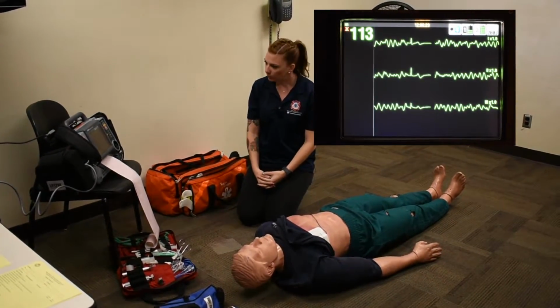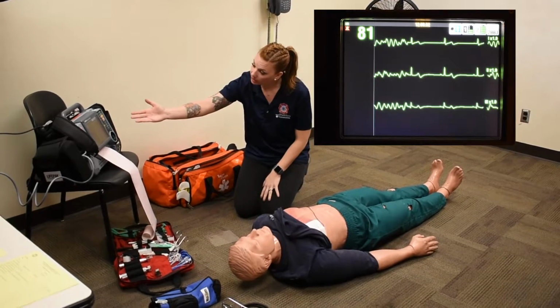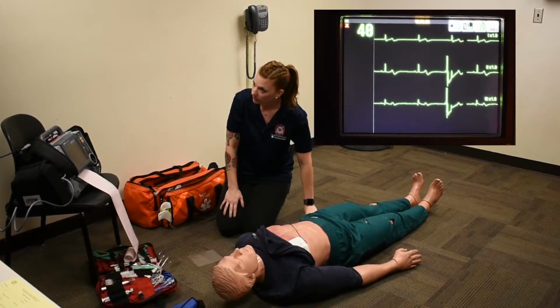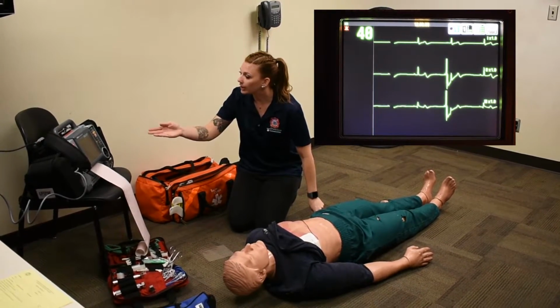2 minutes has passed. I see a change in rhythm. I'm going to check for a pulse. Do I have a pulse? There's a pulse that matches the monitor. Okay, I have sinus bradycardia at a rate of 40.